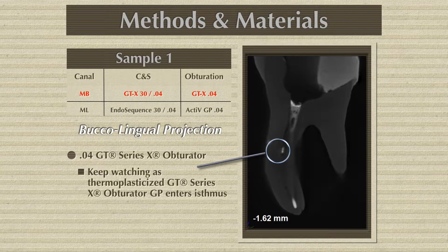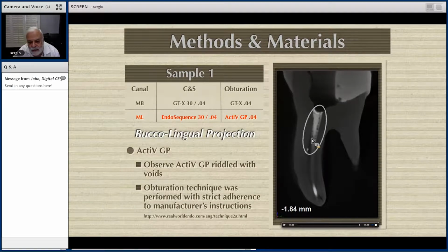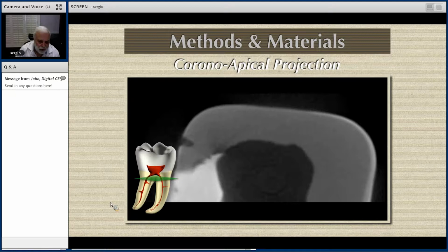And now, my dear friends, here comes the EndoSequence with the single cone technique. You can see on the single cone all the voids. This canal is full of voids, full of voids. And you're going to say, well, Sergio, look at the voids that are on the coronal portion. This is the buccolingual. Let me show you the coronal apical progression.